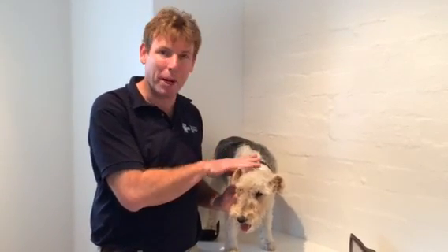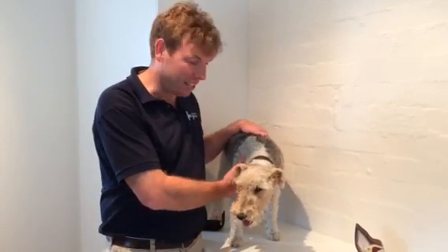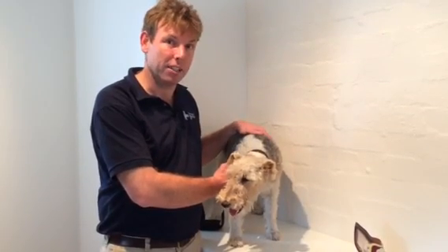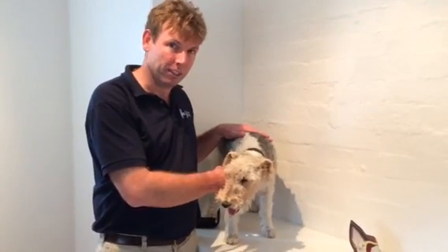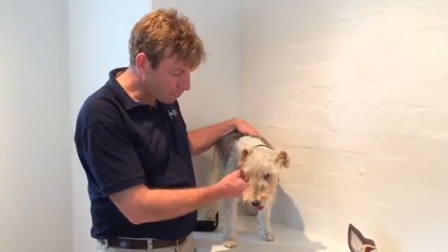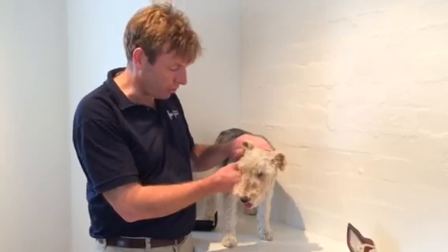In this video we're going to talk about checking and examining the ears. Some dogs are very sensitive around their ears and a muzzle may be required to look in their ears. Most dogs however will allow a basic ear examination, and Oscar is pretty good.